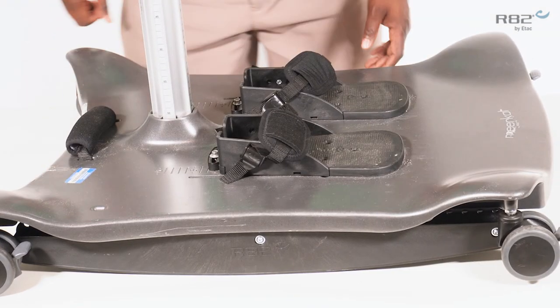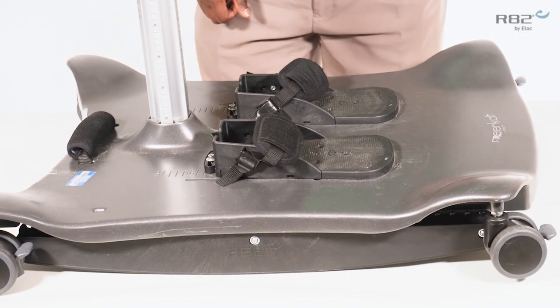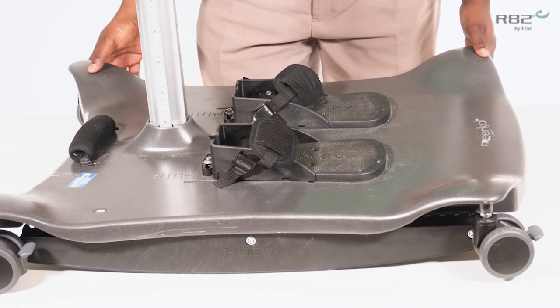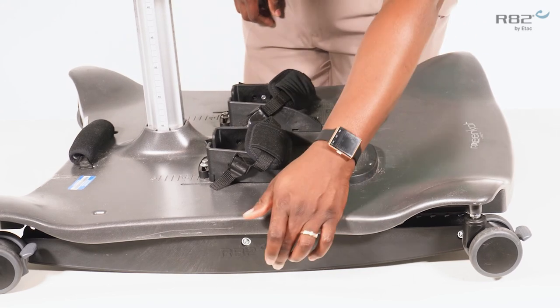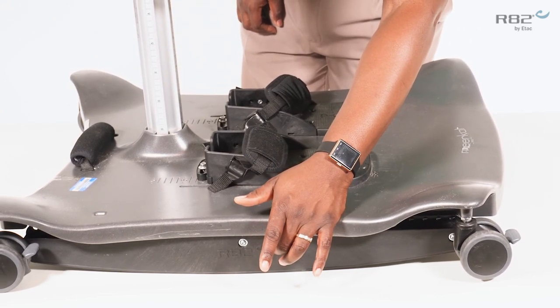Once the rocker is in place, you will notice the wheels will no longer contact the surface, nor will they be able to swivel. The base plate is solely rested upon the rocker.